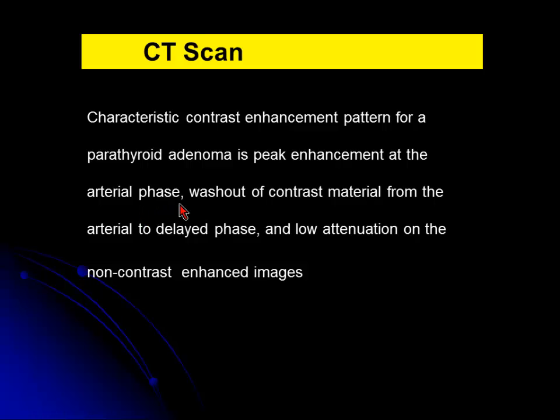If you do a 60 second delay scan, it washes out, that reflects the portovenous phase of the contrast. And when the contrast has washed out and you do a delayed scan, there is low attenuation, which suggests that that is soft tissue, and whatever the enhancement was has washed out and shows the benignity of the nodule.